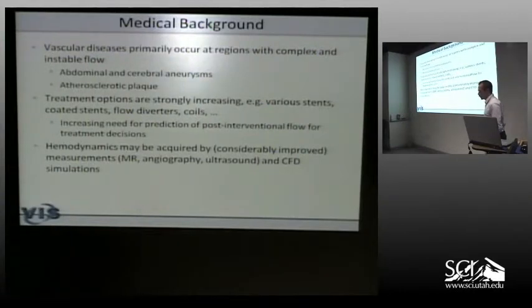On the one hand, by means of measurements in the cardiovascular system, these are quite good and even part of the clinical routine. There are software packages available which allow to measure 3D blood flow in quite good quality. That is not the case for the neurovascular system, because the vessel diameter there is smaller. That is much more difficult. In Magdeburg, we have the fortunate situation that we have a 7 Tesla device, a very special research device, so we started to acquire blood flow there as well, but that is rather rare.